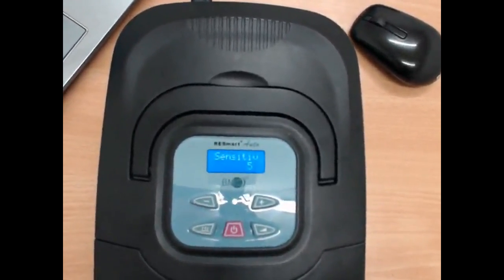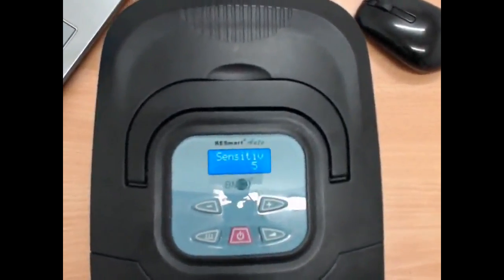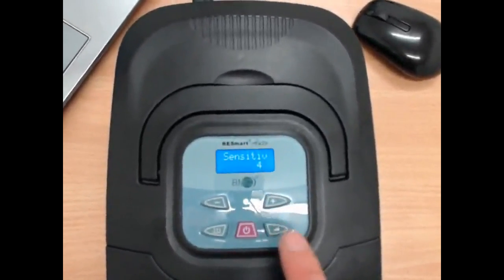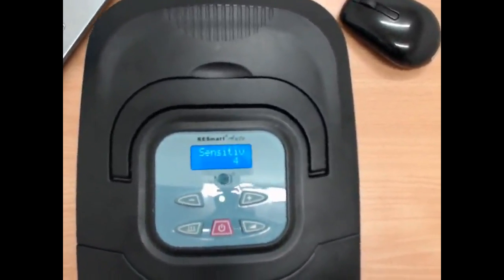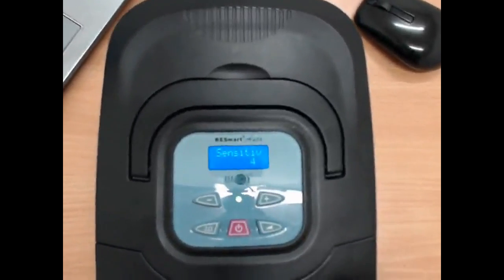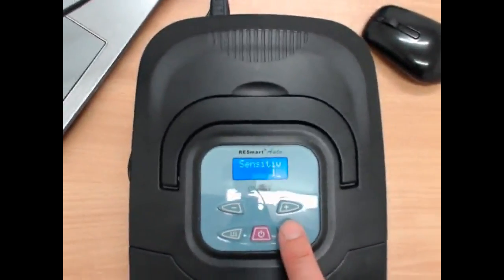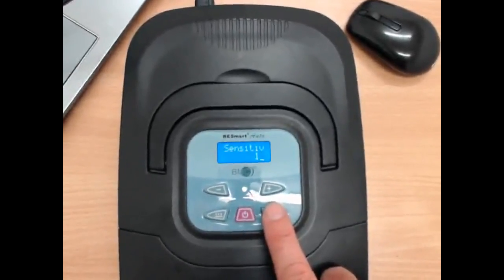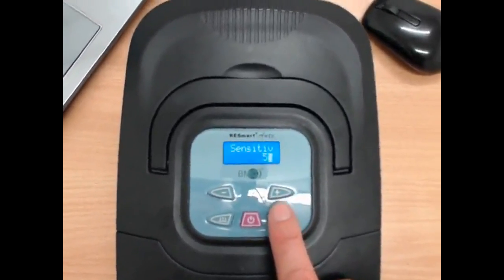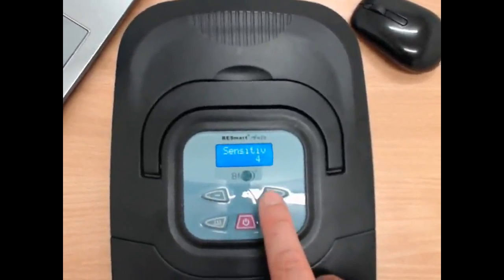Sensitivity is how quickly the machine adjusts to sleep apnea. So I recommend having this on 3 or 4. It's basically the machine's algorithm and how it adjusts to your sleep apnea events. If you have it too low, the machine's not going to be very responsive to your sleep apnea, and too high, it's going to respond very, very quickly. So I recommend 3 or 4 is a good number. I normally set it to 4.